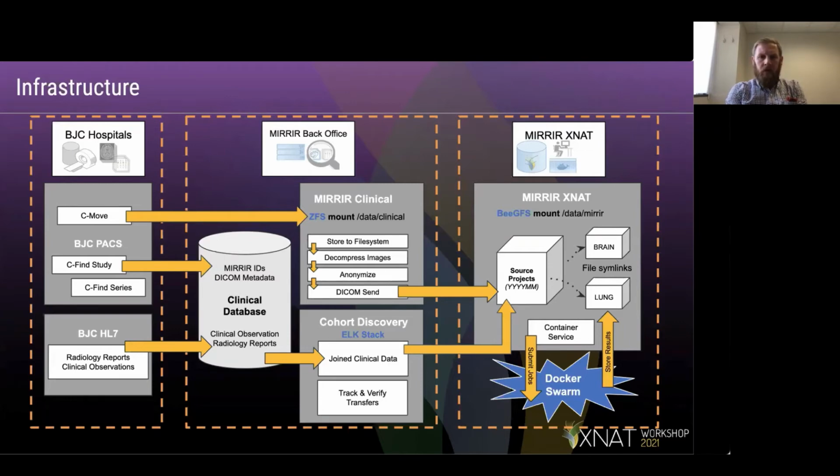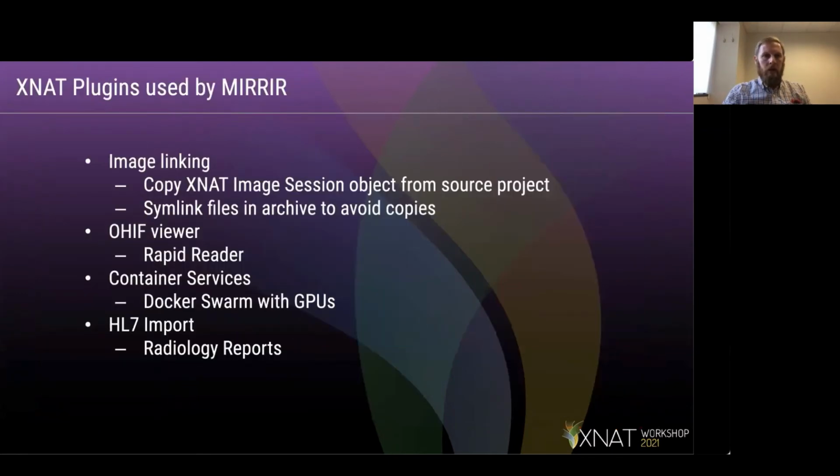We've adopted, we're currently storing most of our ML output as XNAT custom variables. I don't know if that's the best way yet, but it sort of keeps everything in one table. And our hope there is to be able to join this output back with the clinical data as well, and hopefully solve some of the issues so that now, with cohort discovery, you could find a cohort and also filter on these different machine learning outputs. So that's sort of work in progress right now.